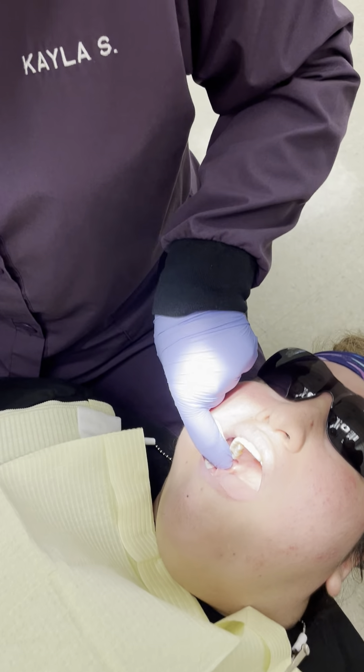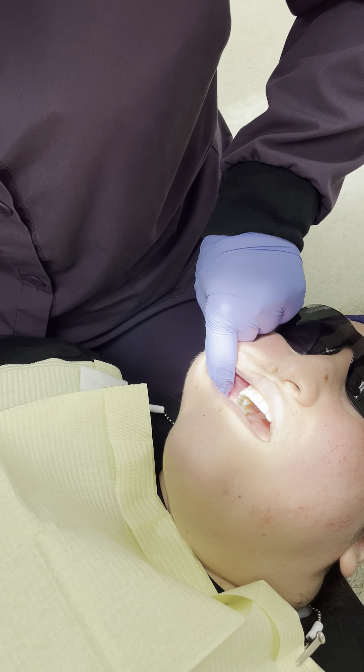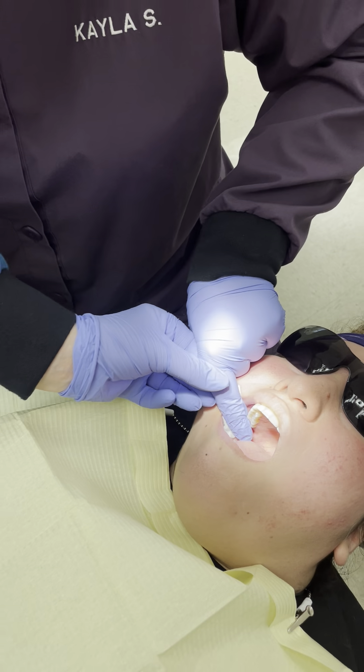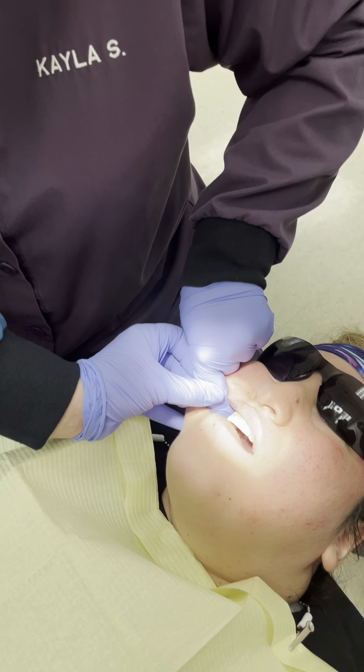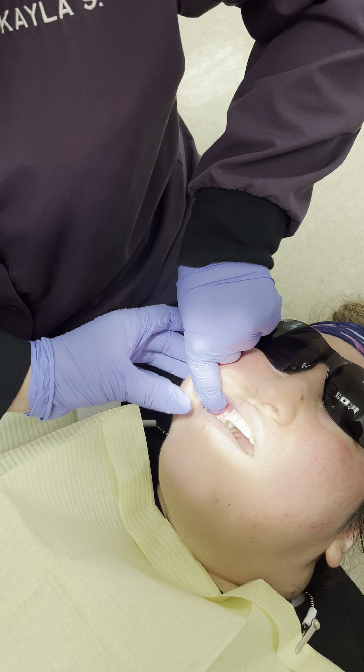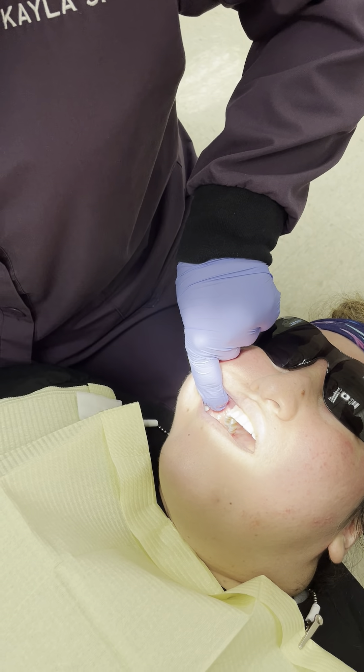We're going to reach back, touch the maxillary tuberosity, and slide our finger. You came down — you've got to stay up high. Now slide right up in that vestibule, keep that finger up there. Now you're going to hook your finger forward. Perfect.